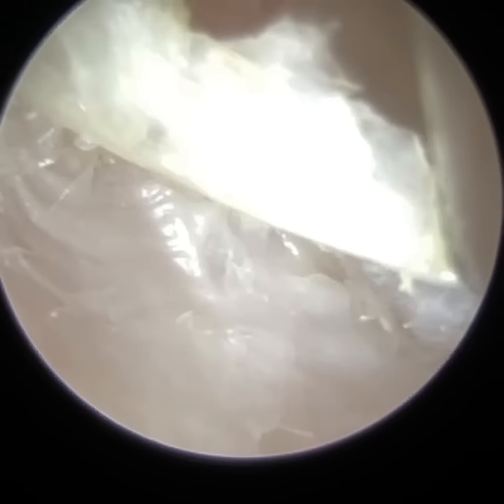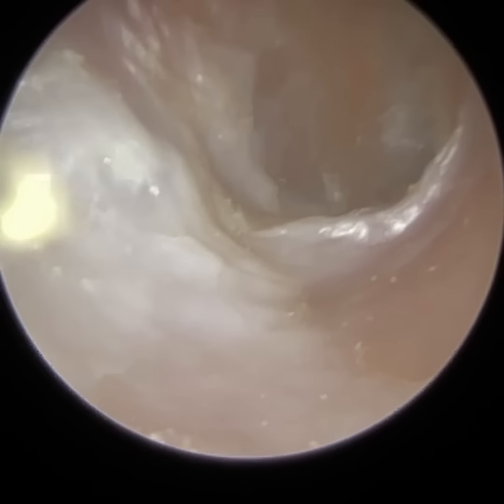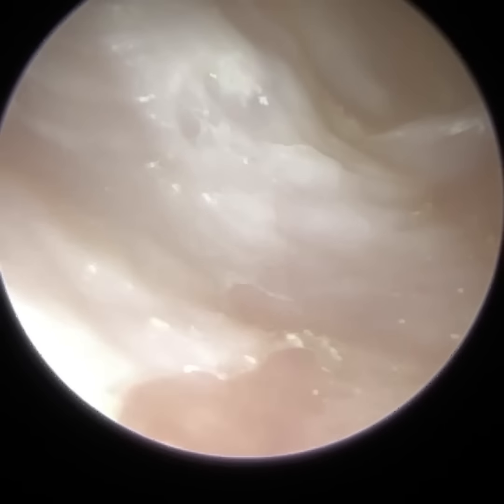As you can see under this, you've got another layer. I'll probably leave that under layer, actually, because it'd be too delicate a procedure, and it would become a bit uncomfortable for the patient. But we shall see.